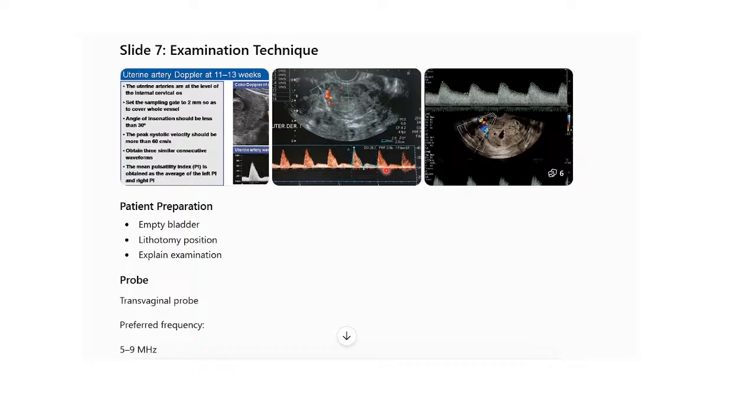So when someone gets pregnant, the vascular channels, all the blood supply going towards the womb, the uterus, dilate and become less resistant. More channels open, what we call angiogenesis. More blood vessels open, and the existing vessels dilate so that they feed the incoming implantation, or the fetus that is coming in. It needs enough oxygenation and nutrition. Because this was non-gravid, that's why we have this relatively higher resistance to flow. That's normal in a normal uterus.